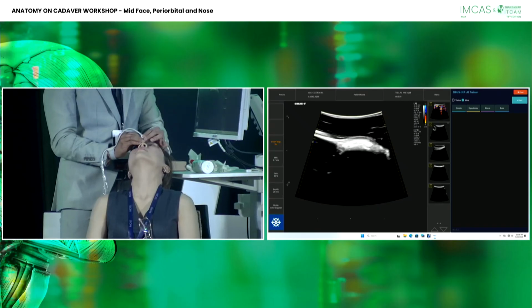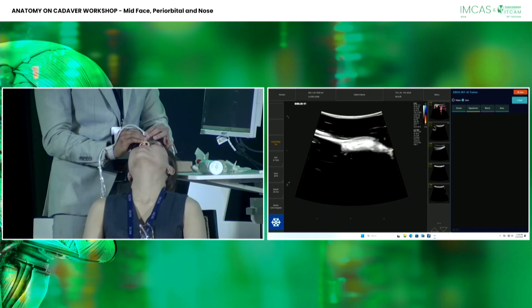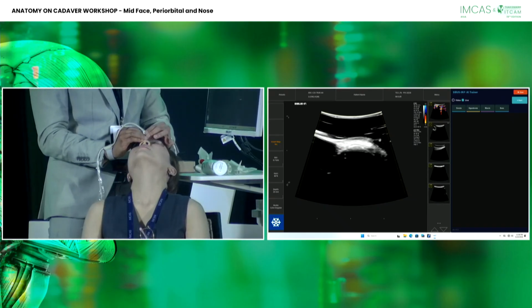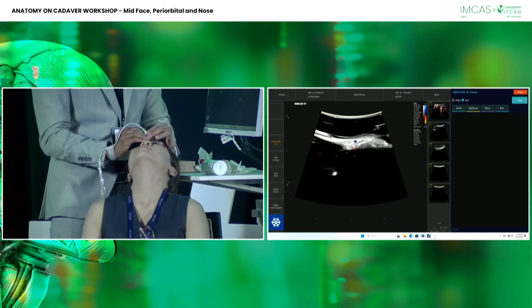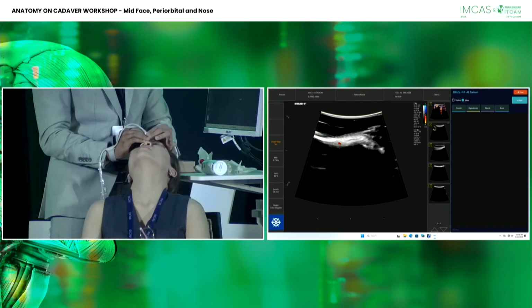And the moment I do a vertical and horizontal vascular mapping of the nose, I am more reassured. There you see on your right a very, very weak pulsating. There you go, you have some vessels here. If your midline is free of vessels, then you can give it a go and have more of an idea of the anatomy of your patient. You see on the left side of the image a pulsating vessel, at that point the dorsal nasal artery. You see it there, beautiful.